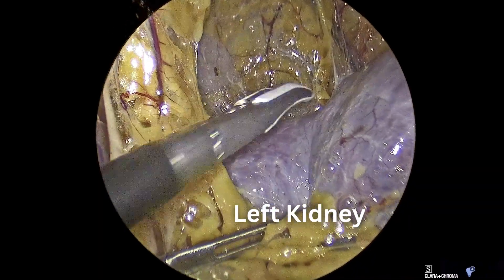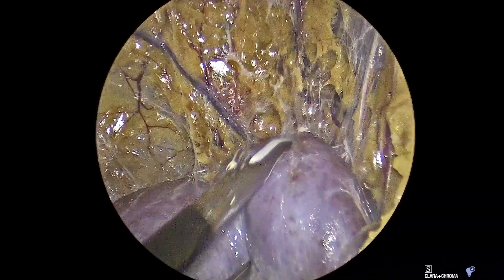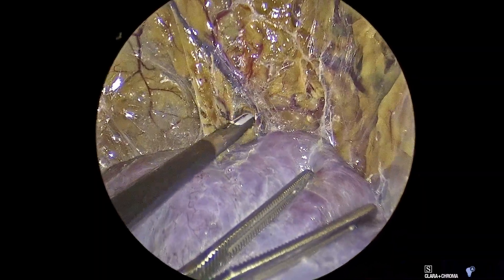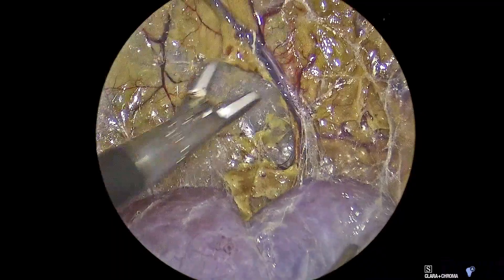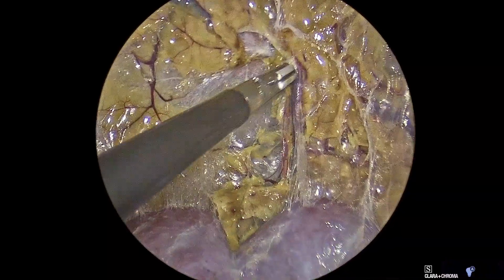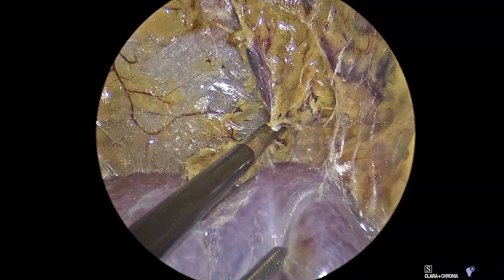As you can see here, I'm mobilizing the left kidney and the dissection proceeds carefully to expose the adrenal gland, avoiding injury to nearby structures like the renal vein or the renal artery. As you shall see soon, the left adrenal vein is located to the right in this picture, draining into the renal vein. Using a ligature device, all small vessels are ligated with thermal energy. I meticulously dissect the adrenal gland from the surrounding tissues.